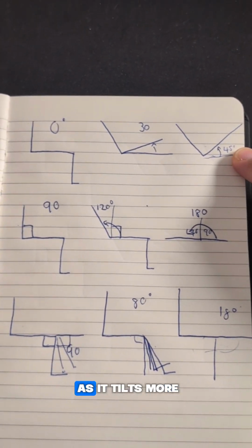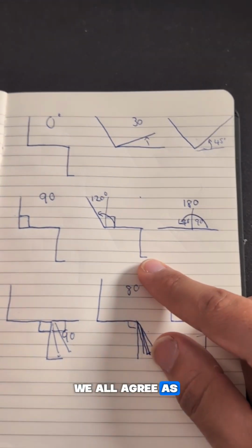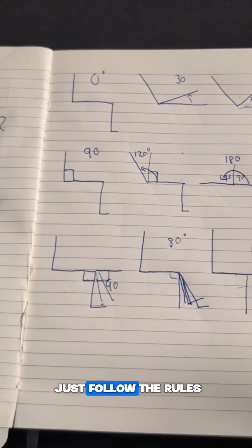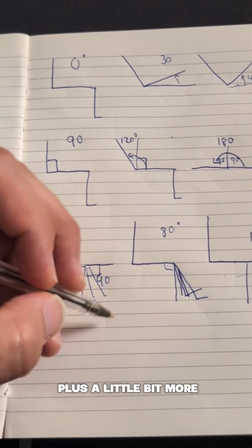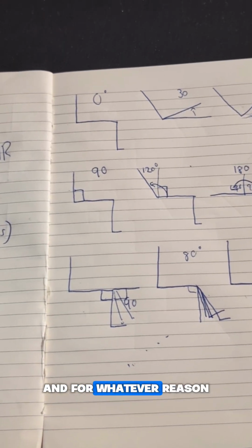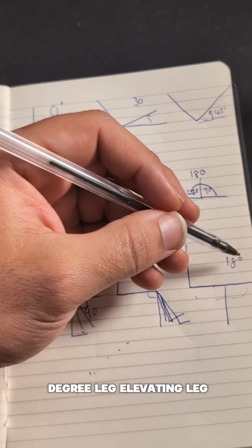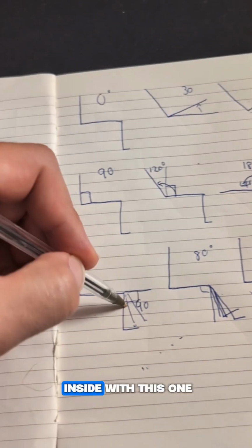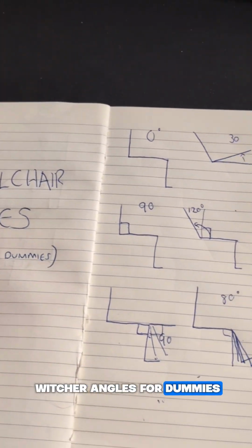So what does this mean for you? Tilt, we all agree. As it tilts more, the degree gets higher. Recline, we all agree. As the backrest reclines more, the number gets higher. This, I would say, just follow the rules of our system. When we're talking about an 80 degree hanger, it just means 90 plus a little bit more. We talk about 70, we go higher and higher and higher. And for whatever reason, when you're ordering elevating leg rest, you either get 170 degree elevating leg rest or 180 degree. That is actually the proper term, but it doesn't coincide with this one. It's a bit confusing, but hopefully that made wheelchair angles for dummies make more sense.